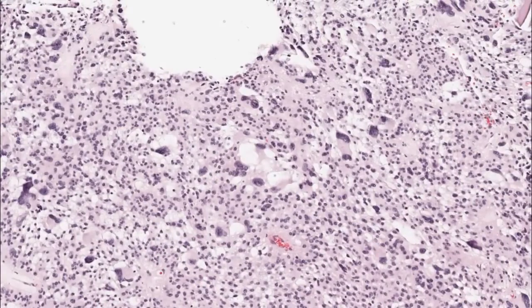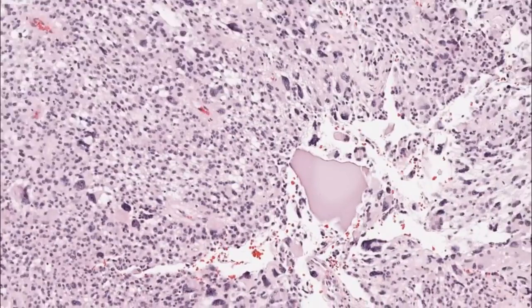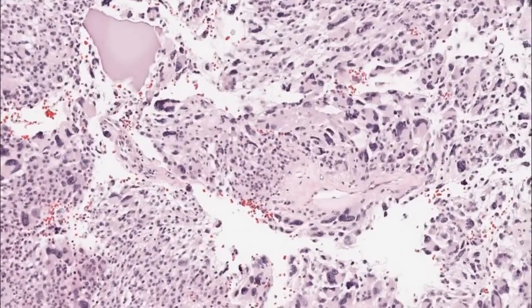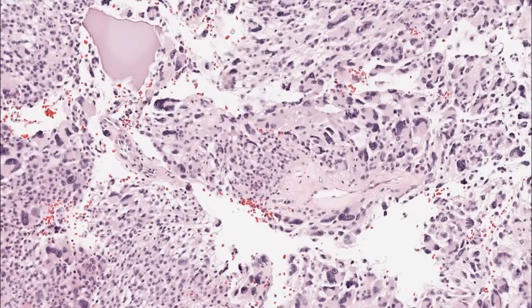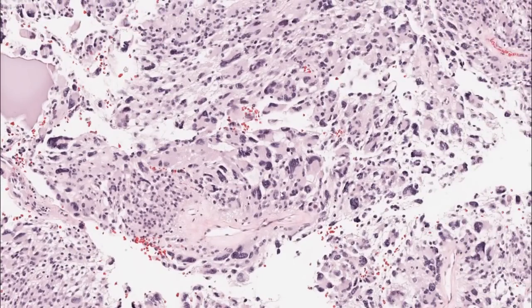Some cysts. More cysts here. A lot of cell processes. Again, very conspicuous pseudorosettes.